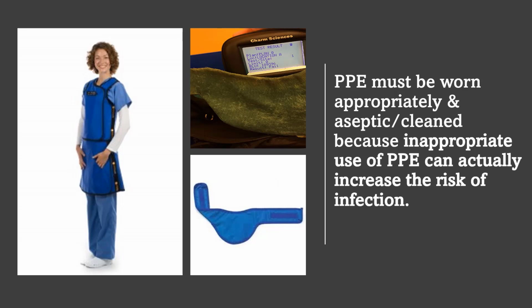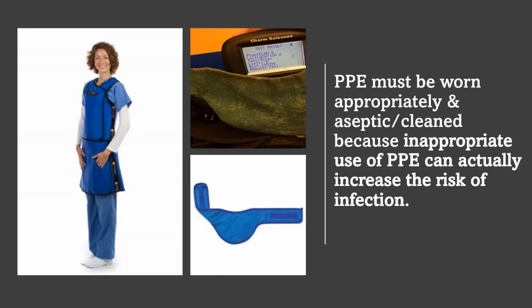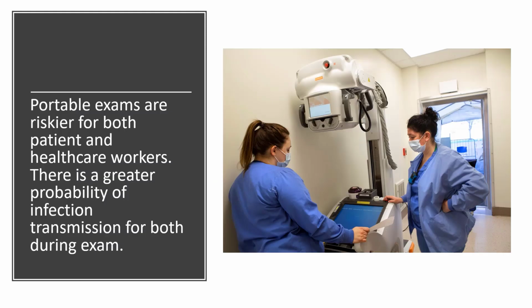realistically, in your facility, do you sanitize or clean your PPE that is shared among the employees? If not, you are basically just picking up all the contamination that the person before you acquired when wearing the equipment. One of the big differences between film screen and digital imaging that is used in this era of the pandemic is the amount of draping and cleaning of the machine, and also the amount of protective gear that is disposable that the operators must don for each examination.